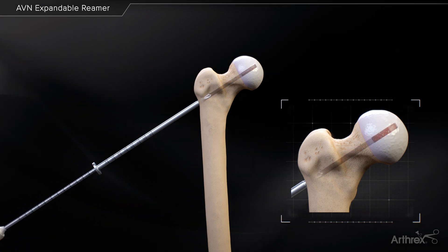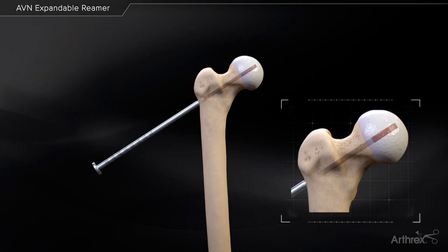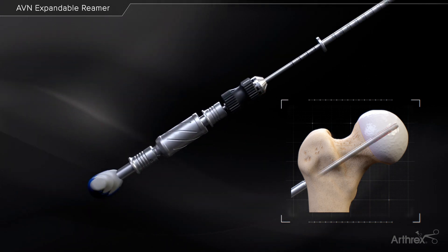Remove the 5 mm cannulated reamer on power so that only the 5 mm drill sleeve is left in place. Insert the expandable reamer through the 5 mm drill sleeve and advance to the proximal end of the socket.